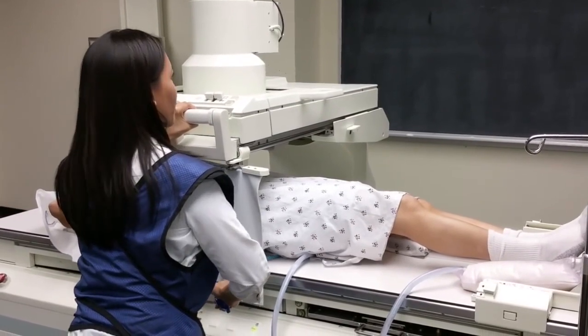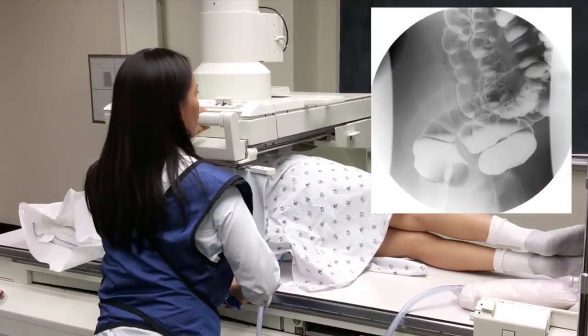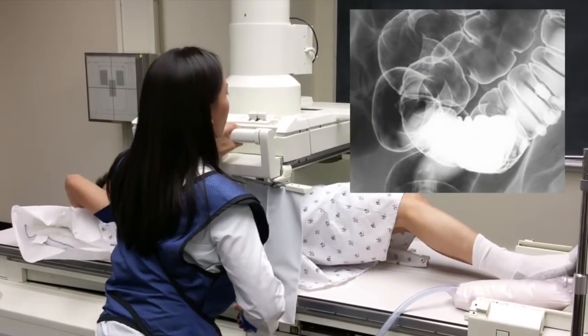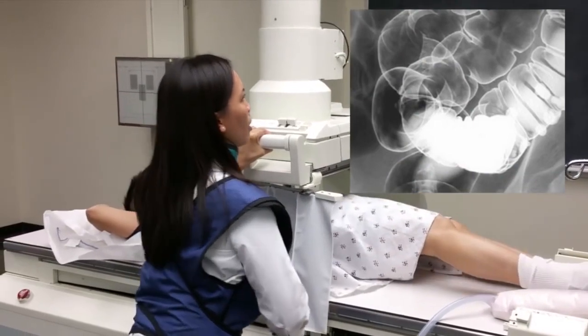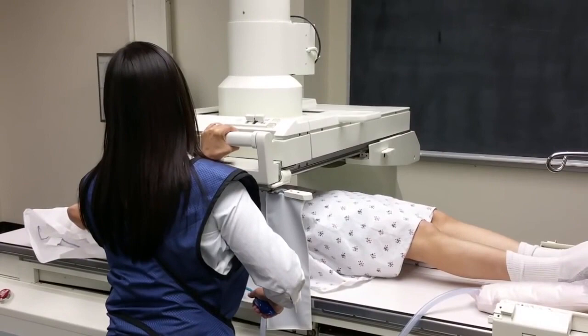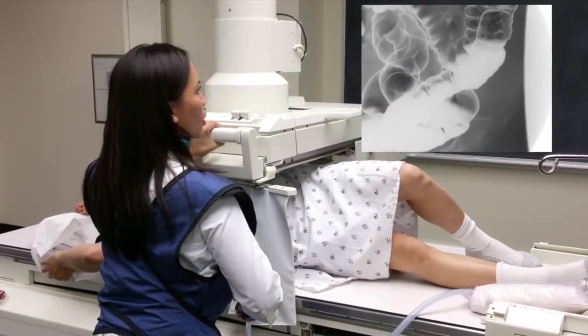I try to make sure I take a couple good double contrast images of the sigmoid colon, usually with the patient supine or in a slight supine oblique, before the barium reaches the cecum, since reflux through the ileocecal valve could cause superimposition of the distal ileum on your sigmoid spot images.